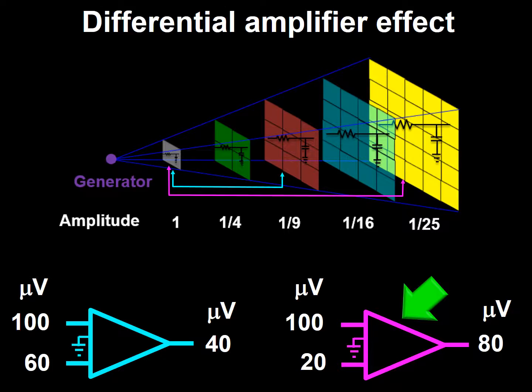This sort of explains why within a distance of 10 centimeters, the amplitude will increase. And that is dependent on the fact that the surveying electrode has to be close to the source in order for this to work. The explanation I use to explain why amplitude starts dropping after 10 centimeters is that at such a distance, the electrode away from the source, the one that goes to input 2 of the differential amplifier, is getting activity from other sources that add up to a larger amplitude entering through input 2 than would otherwise be the case if it were dependent only on the source that is feeding the electrode coming into the amplifier through input 1.